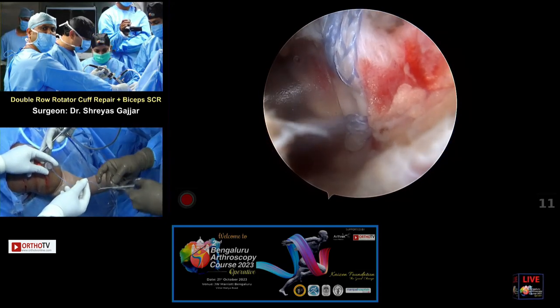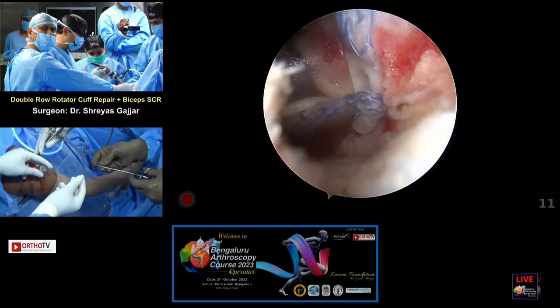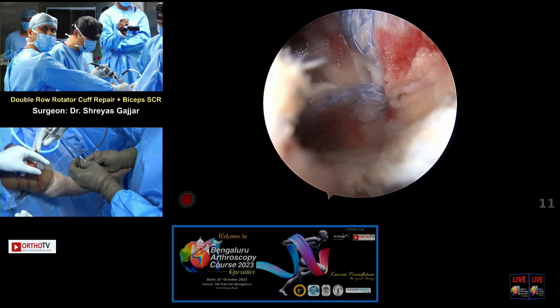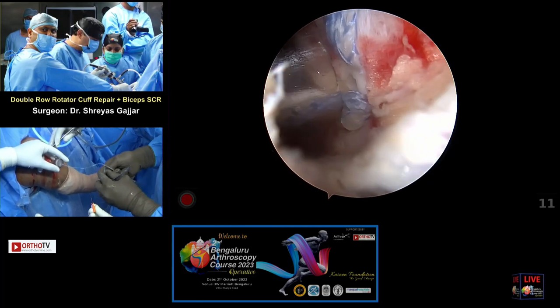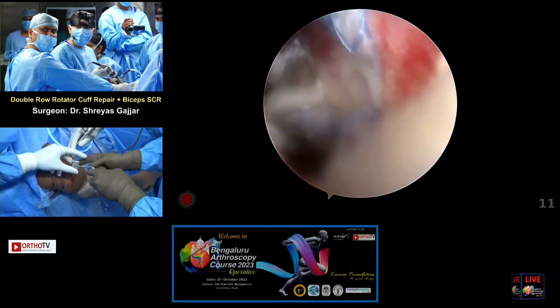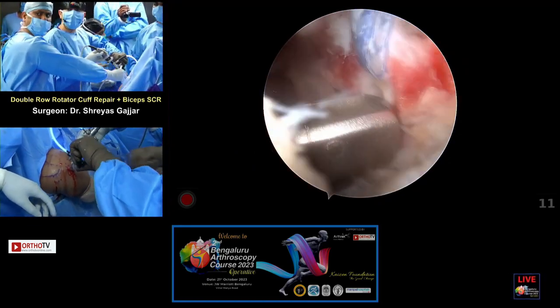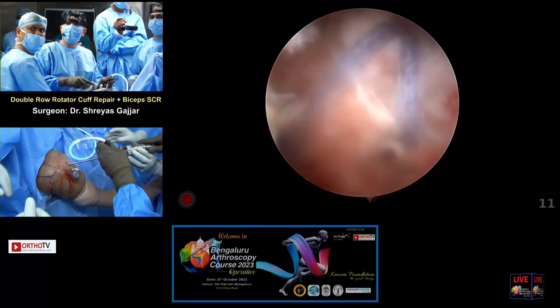Any questions, Sarthak? Dr. Shreyas, yeah. This tear being on either side, close to the biceps tendon, you did a subscap partial repair. Is there any issue with the biceps? Do you expect any issues post-operatively, because you have repaired the tear on either side of the biceps? Any impingement? Biceps tendinitis? Okay, just one second.